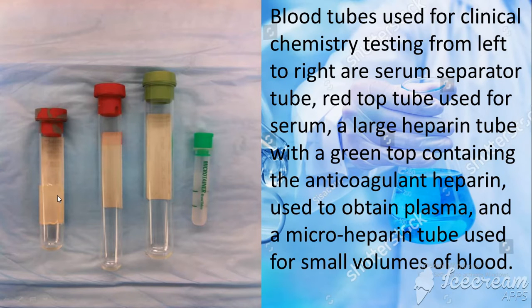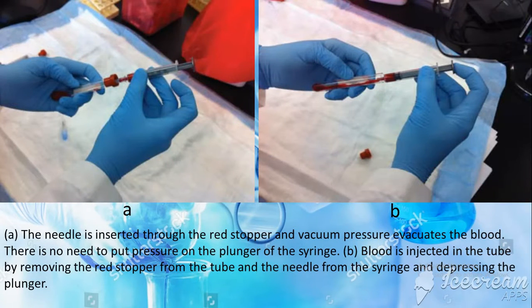And if we want to get serum, we use this type of tube because it does not contain anticoagulant materials.